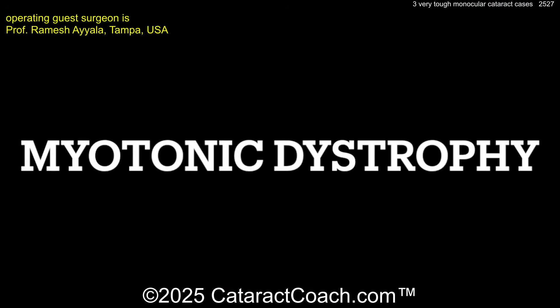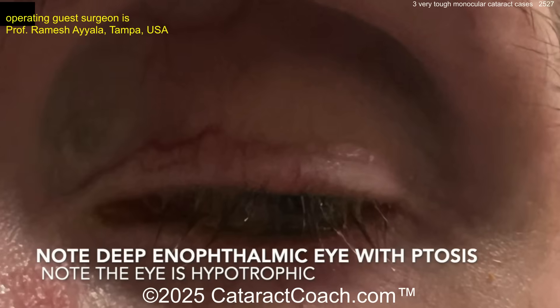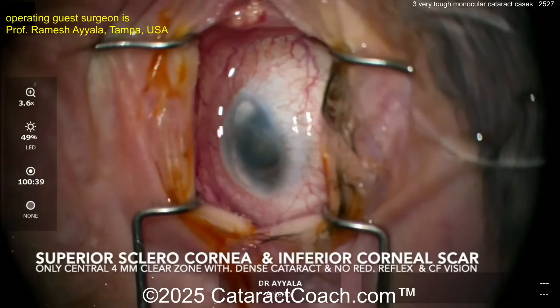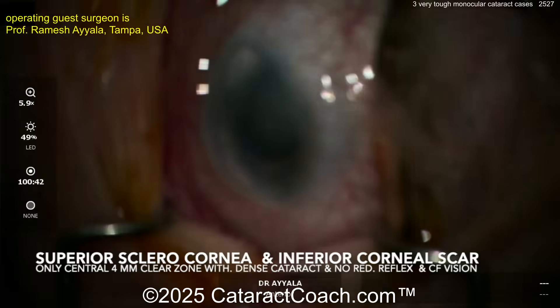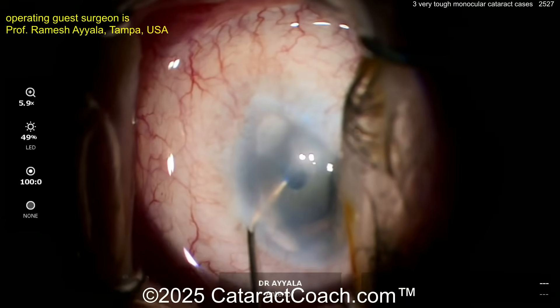Here's another one — a plus 8 patient with myotonic dystrophy. Another small, tiny eye. Look at that deep-set, enophthalmic eye with ptosis. The eye is hypotropic also. Look at that corneal-scleral junction — there's very little clear cornea left. There's also an inferior corneal scar. Yes, the camera is actually in focus; it's just that corneal scar impeding our view here.